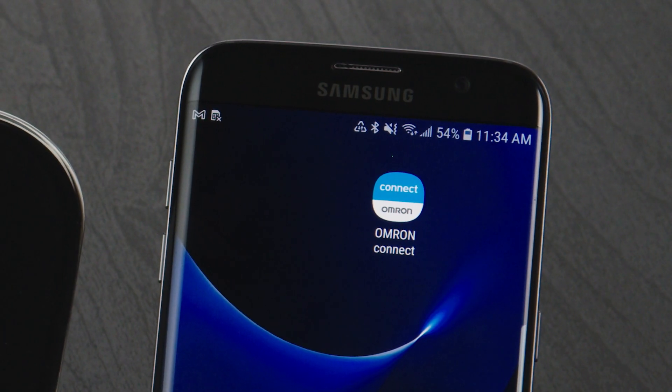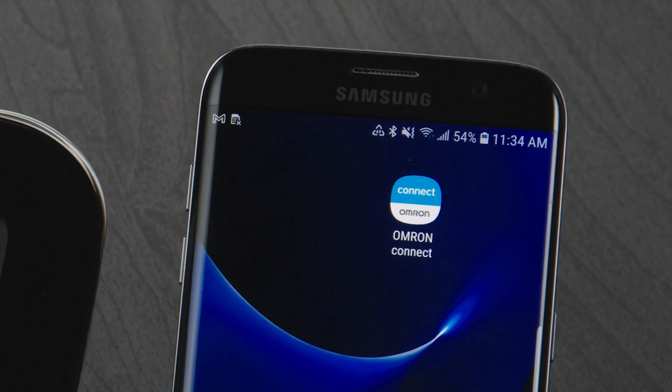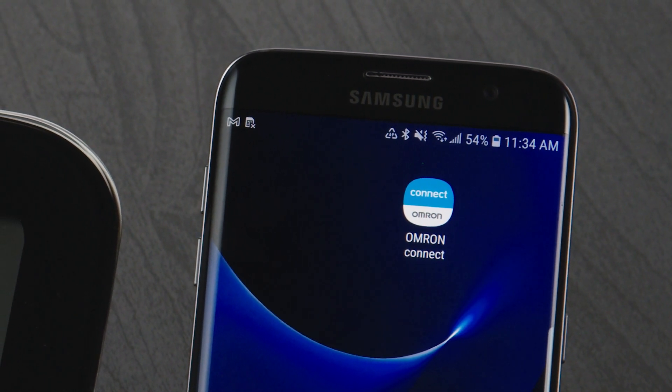Once you've downloaded the latest version of the Omron Connect app from the Google Play Store, you'll need to unpair your Omron connected device from the Bluetooth settings on your phone.